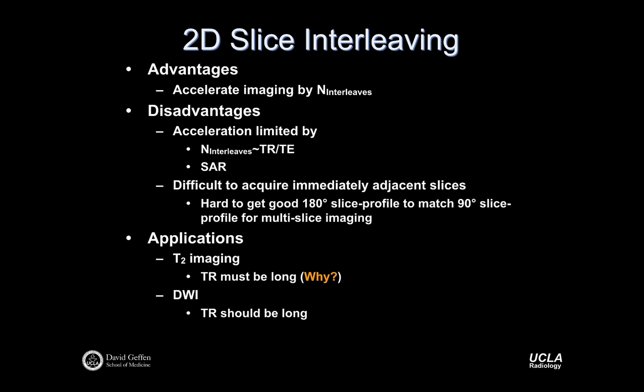And so if we want that signal not to bleed back in, we have to have very long TRs, like 4 or 5 times the T1 of CSF. That could be quite long, 10 seconds, right? We can manage that. We might not choose to have it be quite that long, but it indicates that it needs to be long.